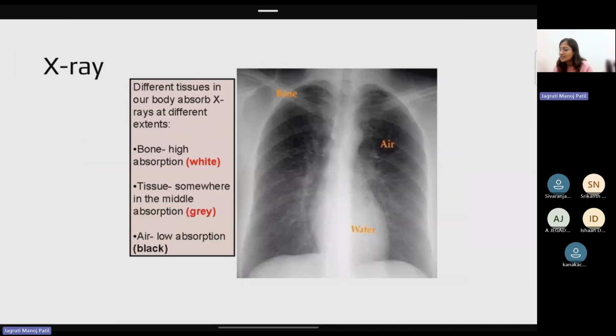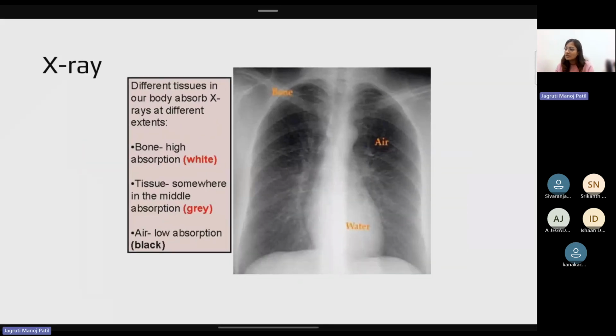Now here, this is an X-ray image. So here you look at the bones. Why do you get such a contrast here? This contrast is because of attenuation, the difference in attenuation between different tissue layers. That's because of how the photon energy interaction is there between tissues.